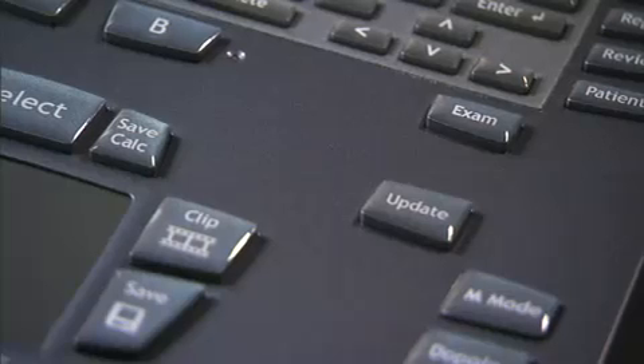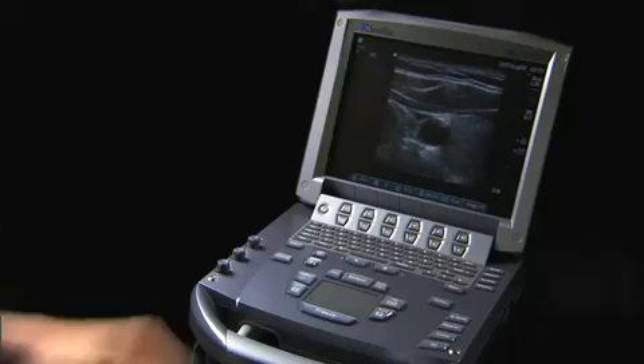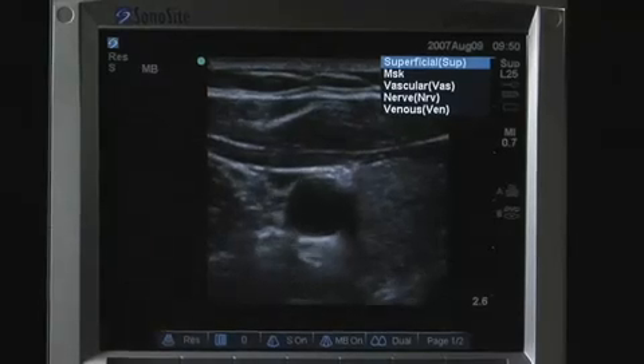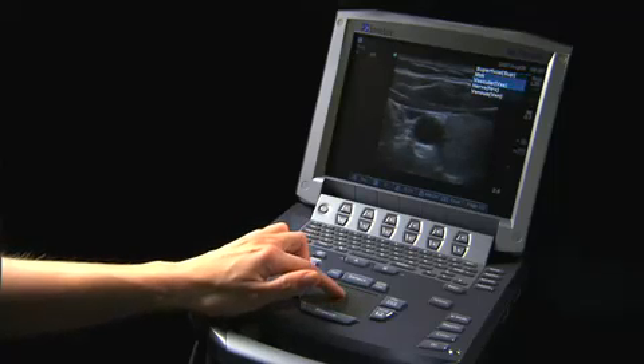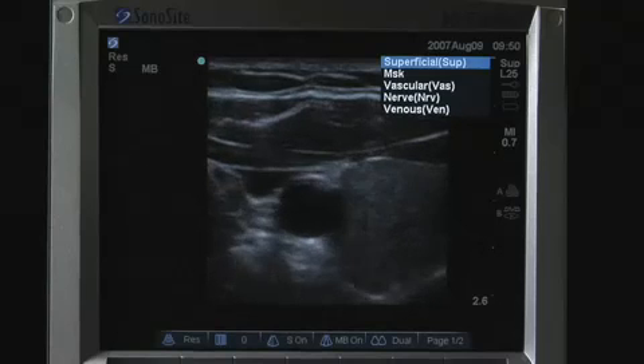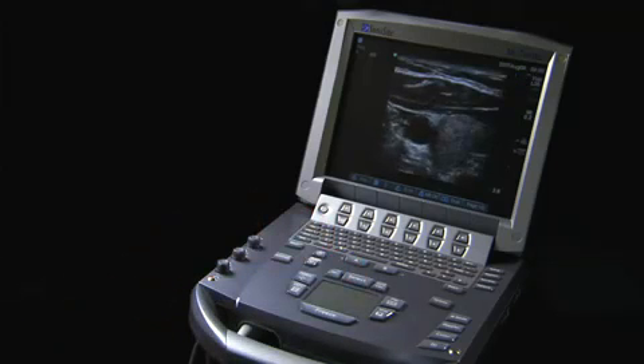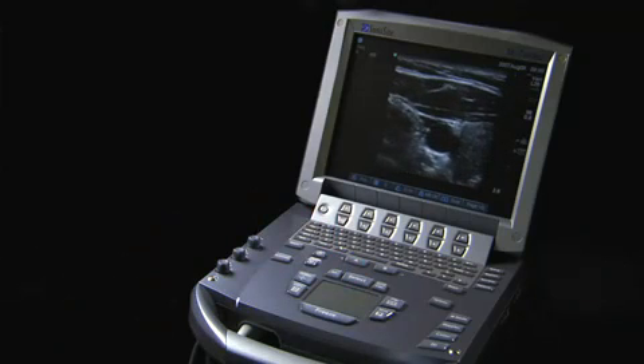The Exam key is located to the right of the touchpad. It can be selected during a patient exam to quickly change exam types without having to return to the patient data entry screen. The exam types menu lists exam types appropriate for the transducer selected, ensuring system parameters are adjusted for optimal viewing of the structure of interest.